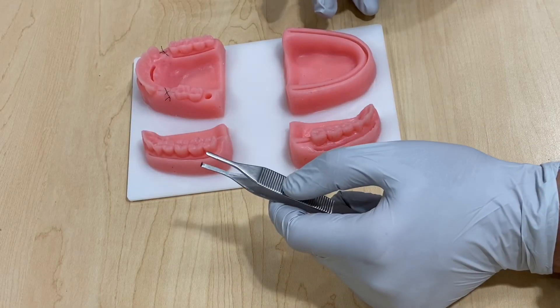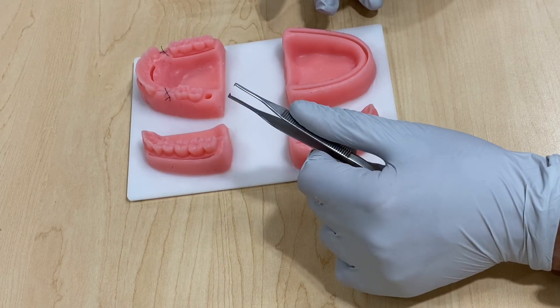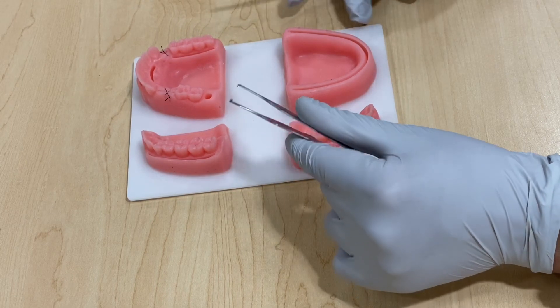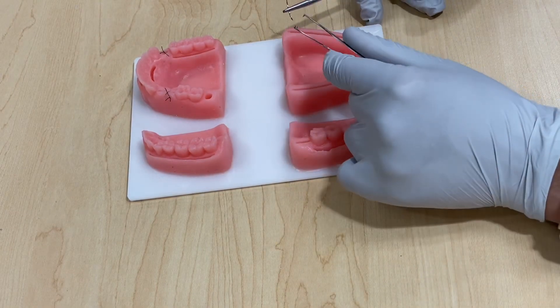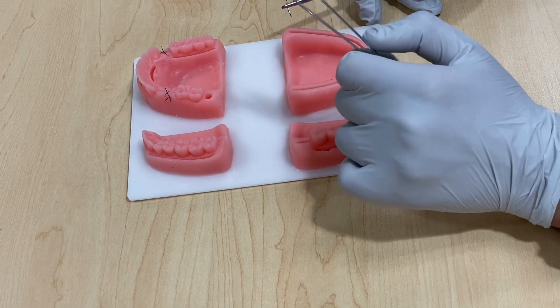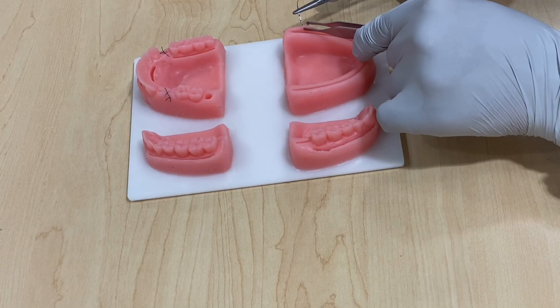Lastly, we're going to do the continuous locking interlocking suture. This suture is very useful for large flaps and is very quick and easy. In future videos I may cover continuous interlocking, horizontal mattress, and vertical mattress. You want to start with your simple interrupted suture — we've done it before.